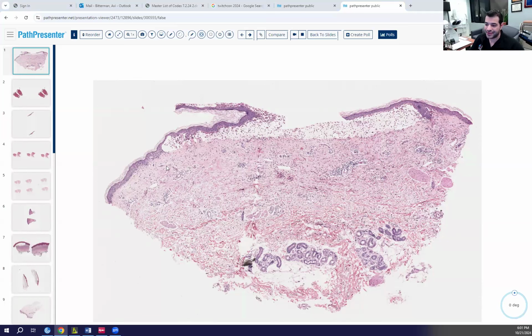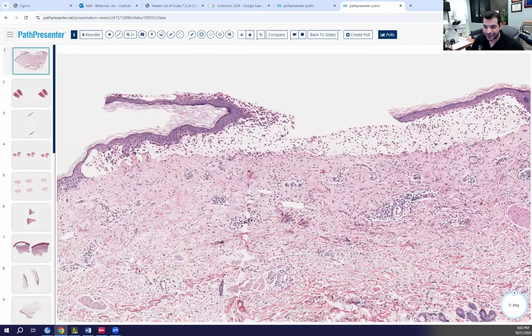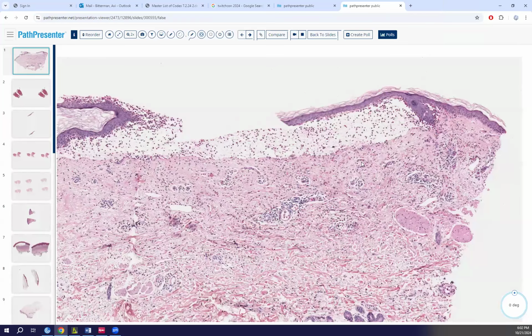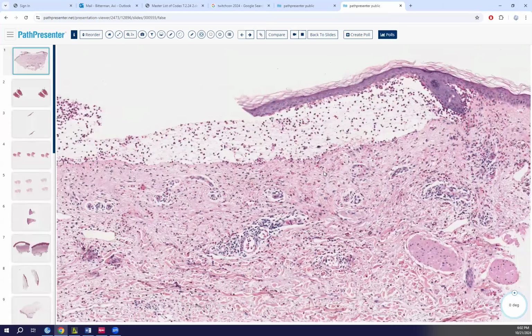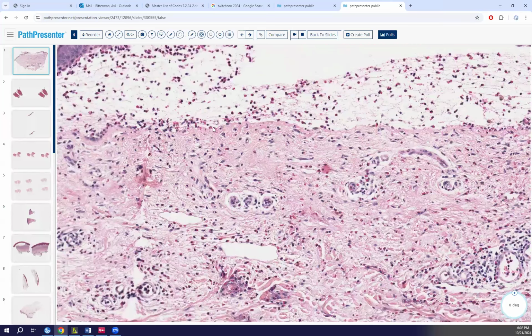There's an infiltrate, but we mentioned that this was what kind of bulla? Subepidermal, right? We agree on that? Yes. Okay. So in the subepidermal bulla category, what kind of infiltrate are we seeing? Looks pinkish. Yeah, EOs. How many EOs? Lots. It's loaded with EOs.